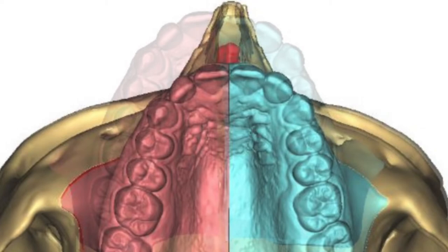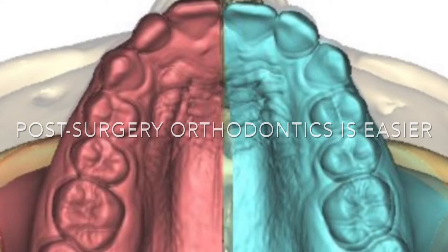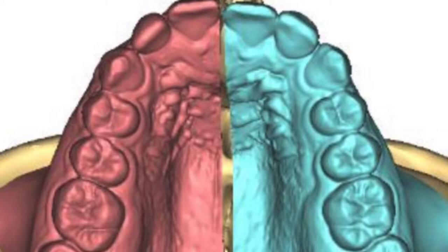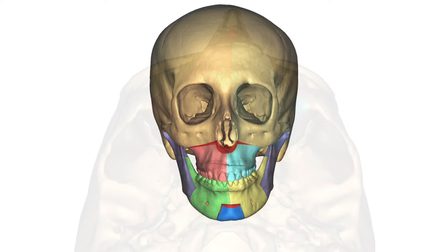It pushes forward the upper lip, giving a fullness there that she never had, and for the orthodontist we're creating perfect arch symmetry for Invisalign that will follow after the procedure. We're also pulling forward the soft palate, preventing the nasal part of snoring.